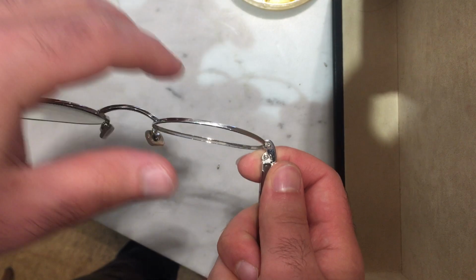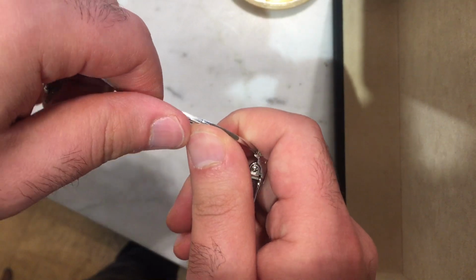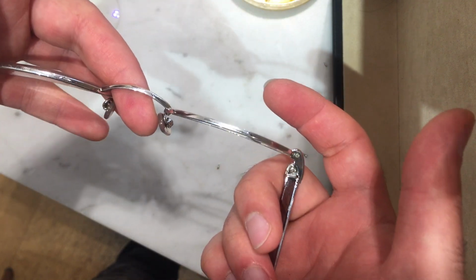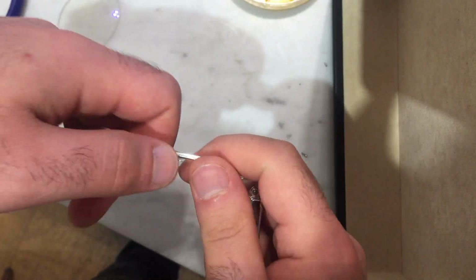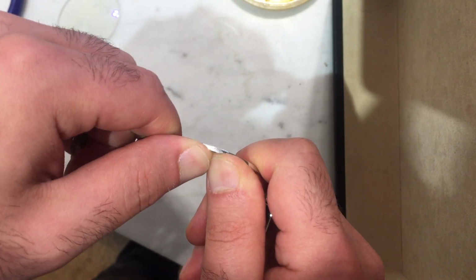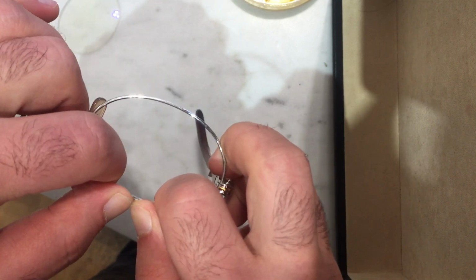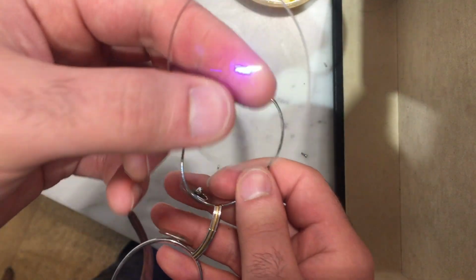Let's say you don't have that on hand either. Well, you have your hands on hand, so you can just grab the frame like so, give it a nice grip. And the more things you do with your hands, especially if you're a beginner optician, some of these things might seem a little difficult, but the more you do with your hands, the more you gain muscle memory and you know how to grip things and how to hold things and how to bend things. So it just takes some practice, but you can do the same thing the tool does with your fingers. Now look at that. We have a more curved frame front. I have flattened out the top and the bottom. As I said, it is not recommended, but if you must, this is what will get you through.